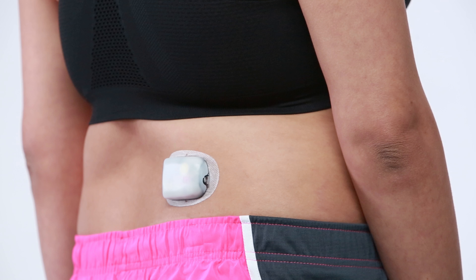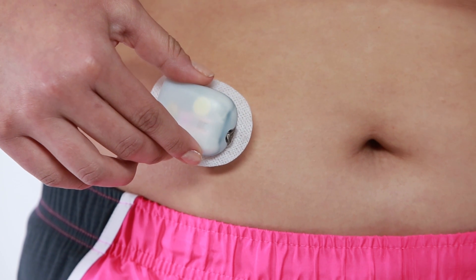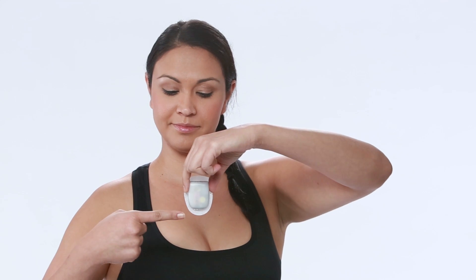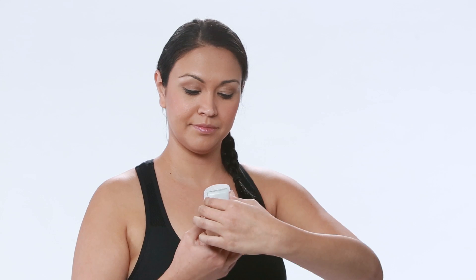When choosing a location, place the pod at least one inch away from your waistband for comfort. If you're placing the pod on your abdomen, make sure to apply the pod at least two inches away from your navel. If you're placing your pod on your arm or leg, position the pod vertically for comfort.